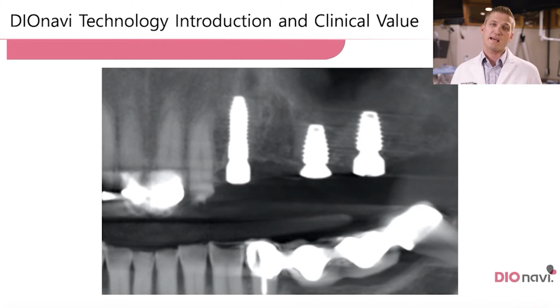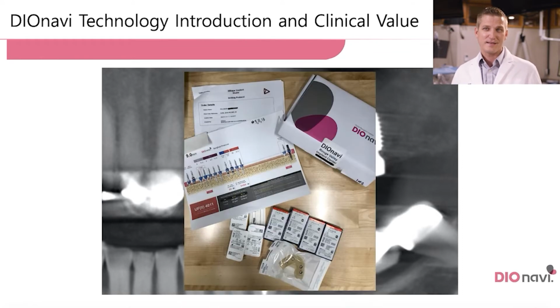So when we talk about this technology and how does it really benefit us as providers, I think that X-ray tells the whole story right there. Maybe one last little thought.